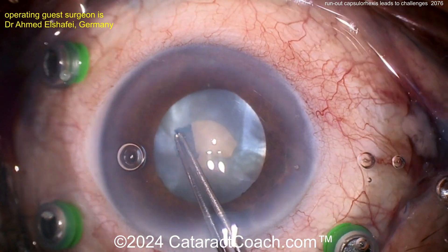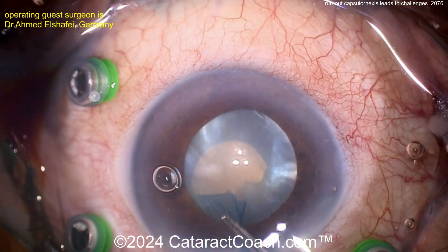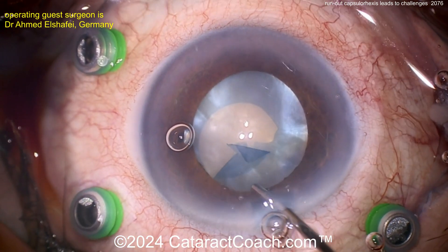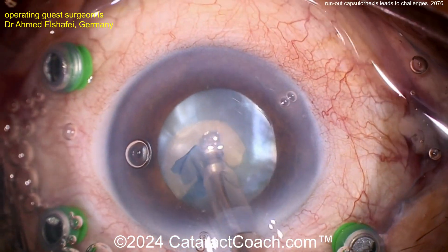That's not a big pupil, so I'd make this rexis much larger than that. Then come around here and keep going — now it's starting to run out. This is that danger zone we've talked about. We have a video on cataractcoach.com talking about the capsulorhexis danger zones. That's one of the two danger zones.